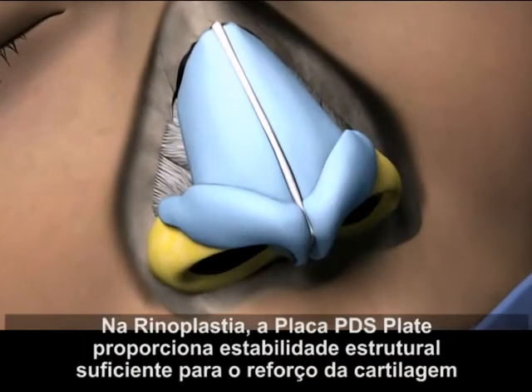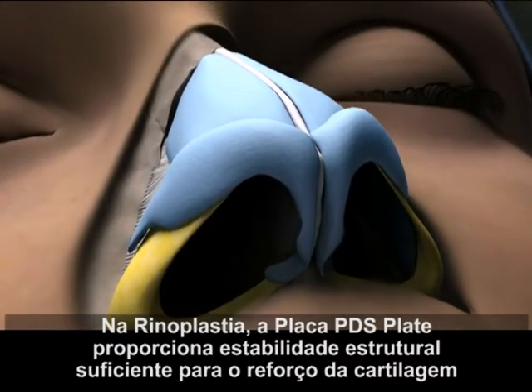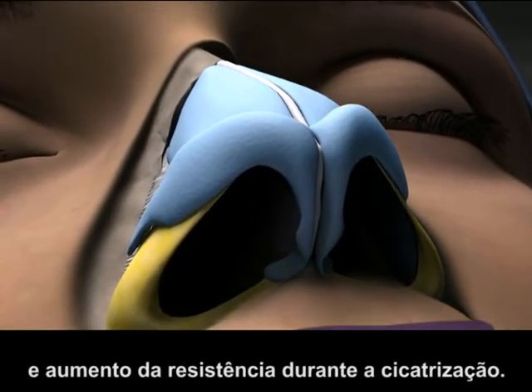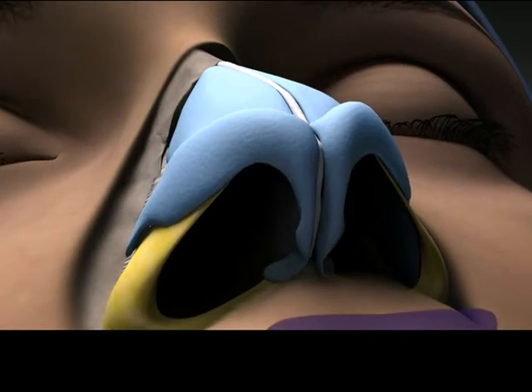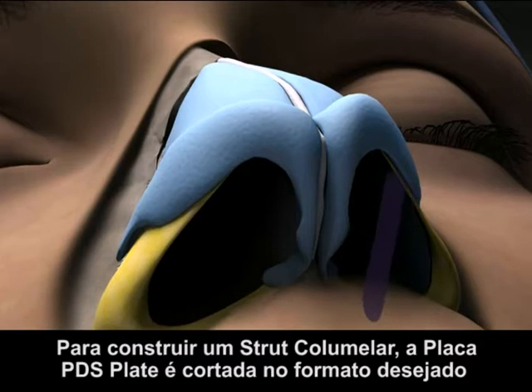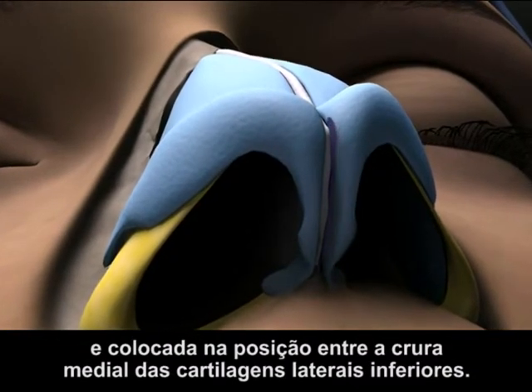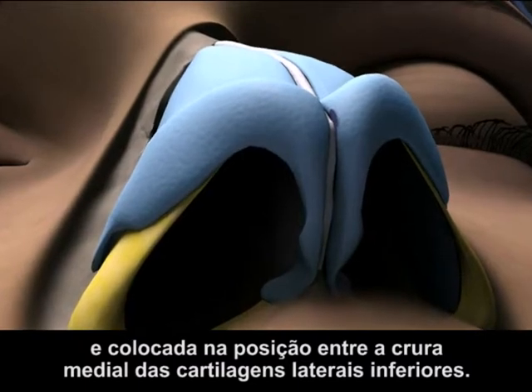In rhinoplasty, PDS Flexible Plate introduces sufficient structural stability for cartilage reinforcement and increased strength during healing. For constructing a columellar strut, the PDS Flexible Plate is trimmed to the desired shape and placed in position between the medial crura of the lower lateral cartilages.